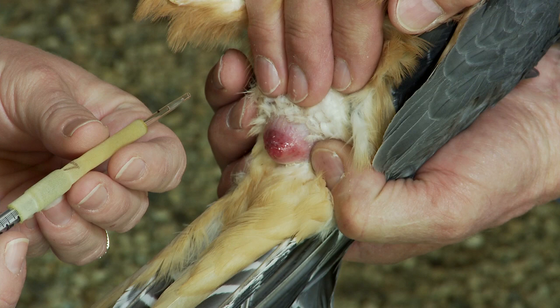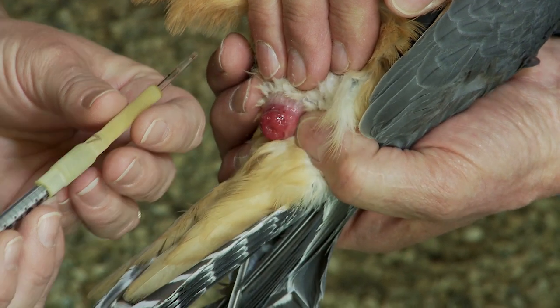You should see the cloaca push outward. This is the oviduct pressing against the cloaca. Then, use your thumb and index finger to spread the cloaca sideways and back into the bird, exposing the oviduct. By simultaneously applying pressure to the abdomen and spreading the cloaca, you can easily control the amount you evert the oviduct, which is usually just a few millimeters.